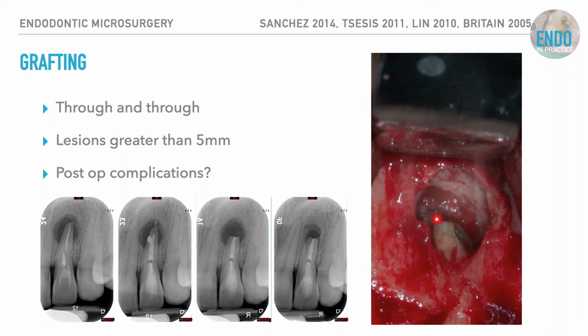So can you see just here, this is the soft tissue of the palate. Potentially, if I now put a bit of a membrane over that and put some BioOS and BioGuide in there, I might get better regeneration than I did, because this is essentially forming the scar that we talked about in the first or second slide. But if I had immediately stuck something radio opaque in here, I wouldn't have been able to assess any healing at any follow-up appointment, because it would have all been radio opaque BioOS.